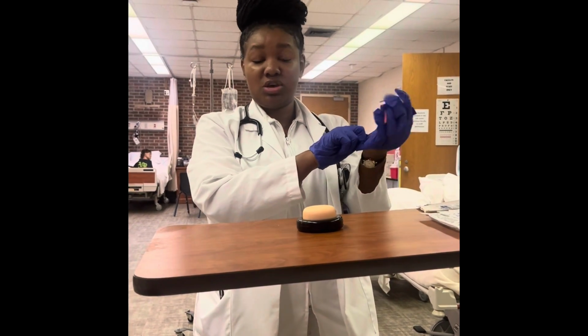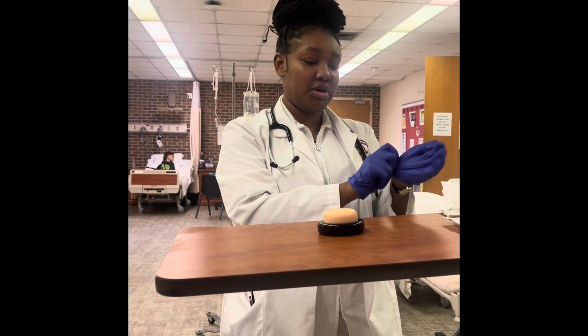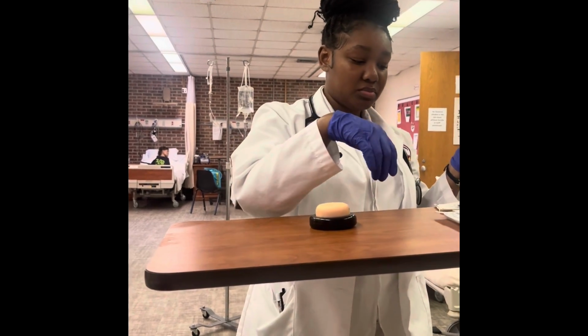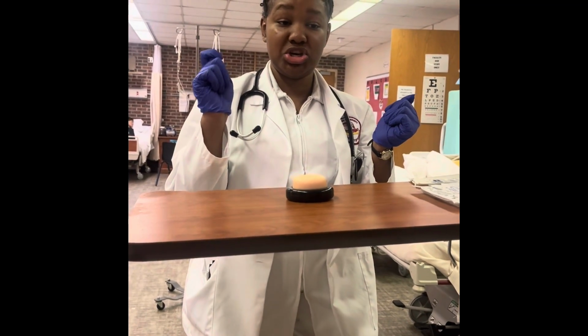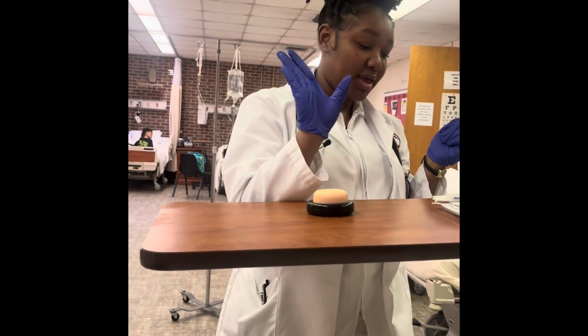Yes, I'm going to start with your sub-Q injection. All the different sub-Q sites are the lower abdomen, your upper outer portion of your arm, and the anterior thigh, but I'm going to be doing your lower abdomen today. I saw on your MAR that you got your injection on the left side last time, and since we should be alternating with each injection, I'm going to do it on your right side. Is that correct? Okay, thank you.